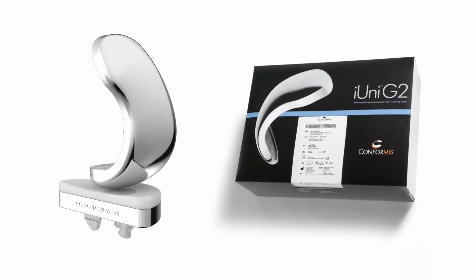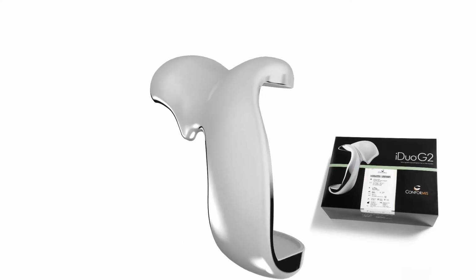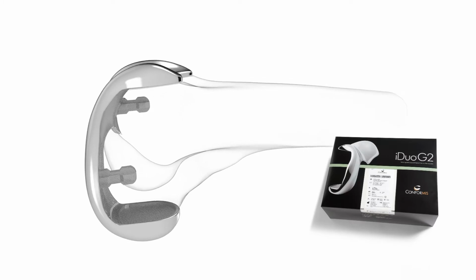What Conformis has allowed is that it's given me a wider comfort zone, so I feel more comfortable doing artificial knees in younger patients. And what's terribly important to me with the Conformis knees is they allow the complete range of options. We can do a medial uni for just medial osteoarthritis, and what's really important is now for the first time we've got a really decent option for a lateral uni. And then if the patient's got medial and patellofemoral or lateral and patellofemoral, then we can do 2 compartments, and that's a very novel approach.